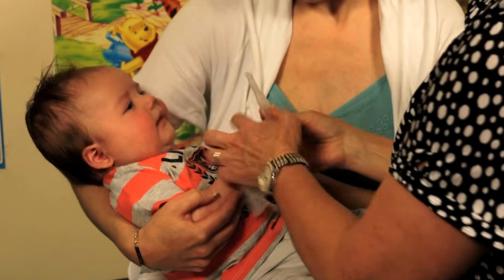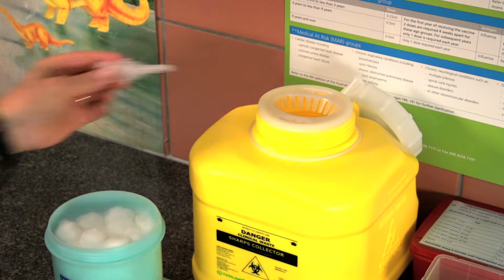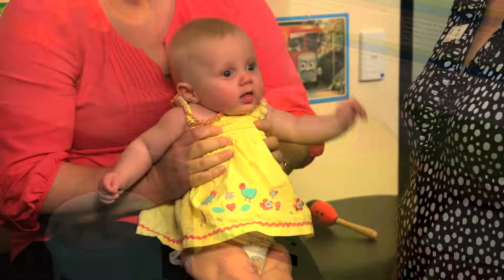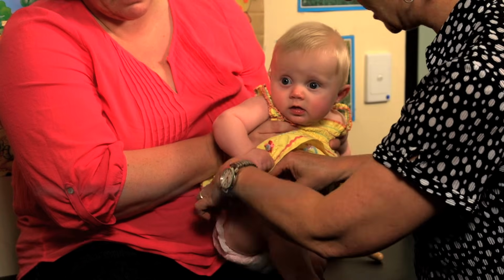Discard the empty applicator and cap into an approved biological waste or sharps container. Sharps containers are normally yellow and clearly labelled. We will now look at how to position an infant prior to intramuscular vaccination.